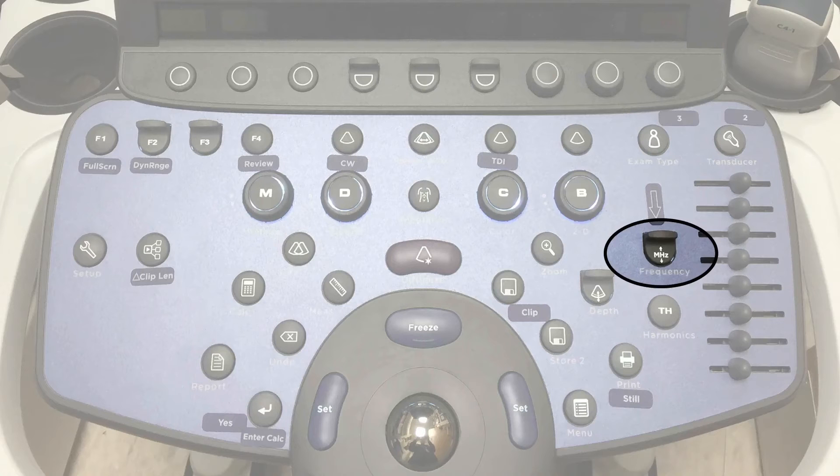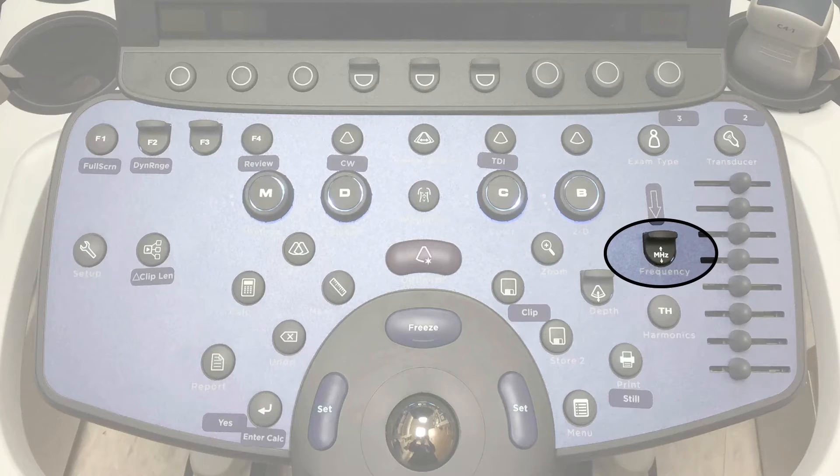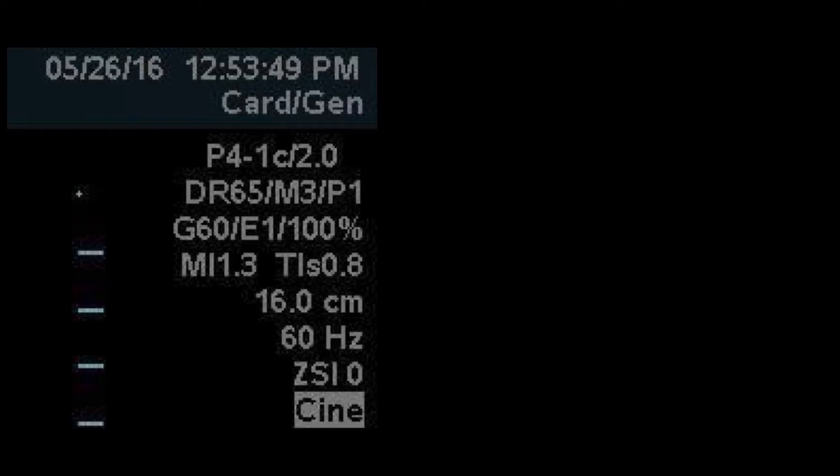To optimize your images, there are several controls you will use. The first is the frequency, where toggling down or up will increase or decrease your frequency. Compared to other systems which may only display general or pen labels for higher, mid, and lower frequency, the Zonari will actually display the frequency number.